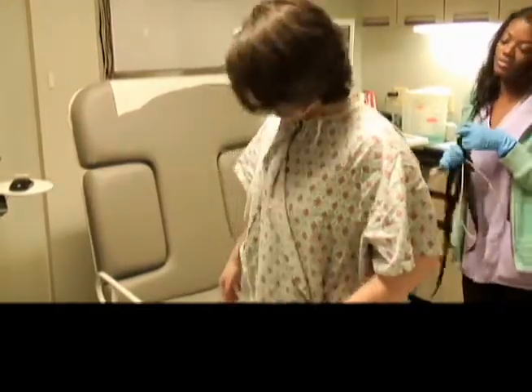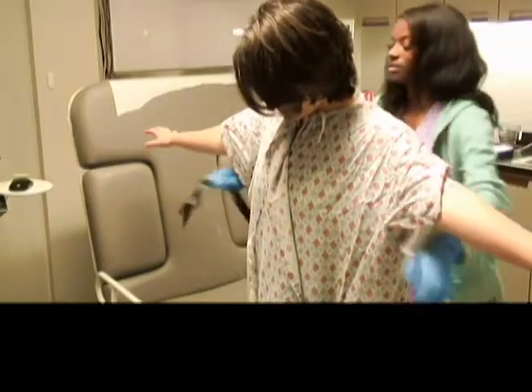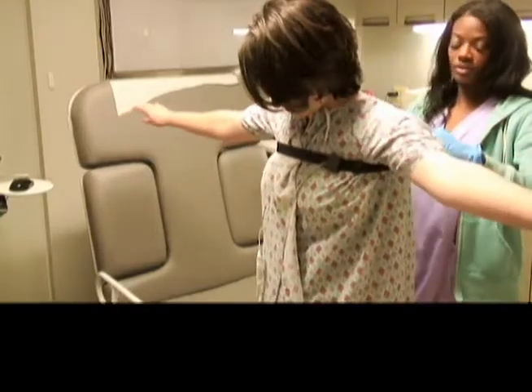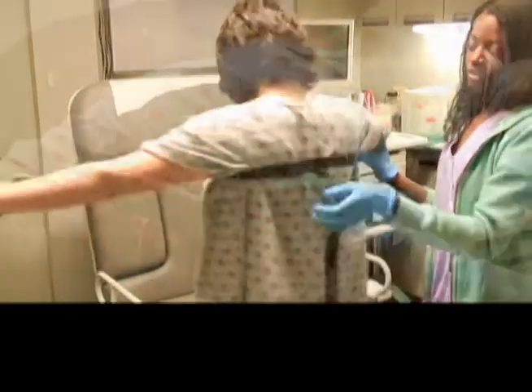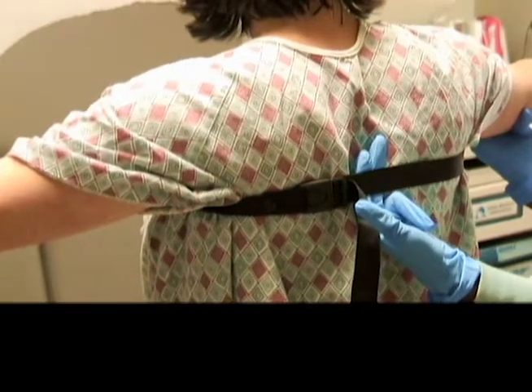You're going to lift up your arms, and we're going to put this belt around her on top of the gown, right over her chest. We want to make sure the belt is snug. If you can turn around, so we can see there isn't very much space here. It's very snug, but not uncomfortable.